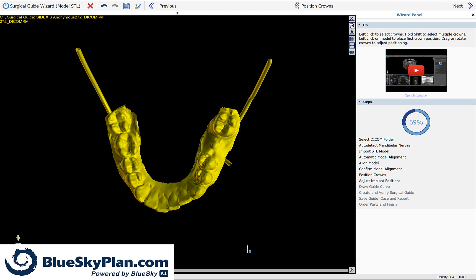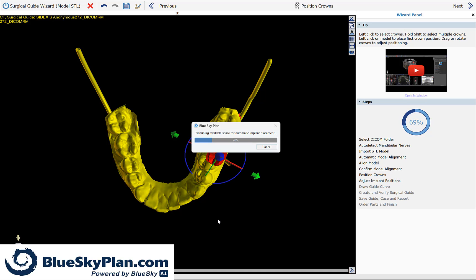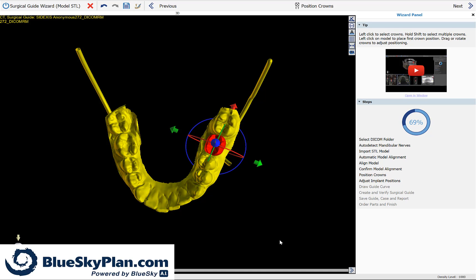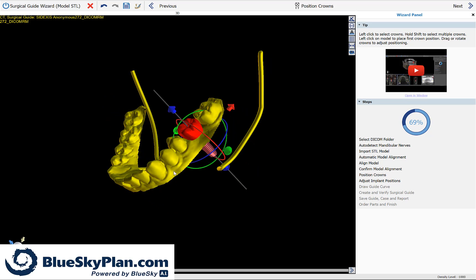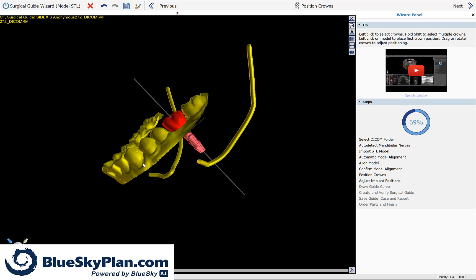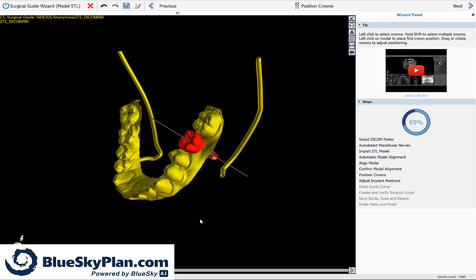The software now prompts you to click once in the relevant section where the tooth should be placed. I am intentionally going to click a bit off to the side and we're going to see the software run the automatic implant placement. So I'm going to left click with my mouse button. We can see the software is examining the relevant positioning.